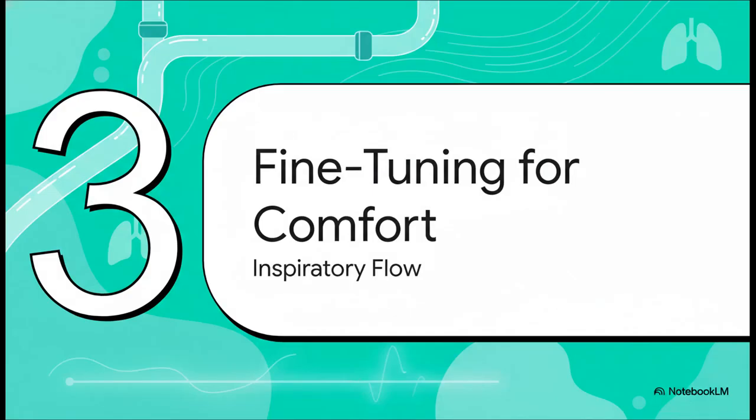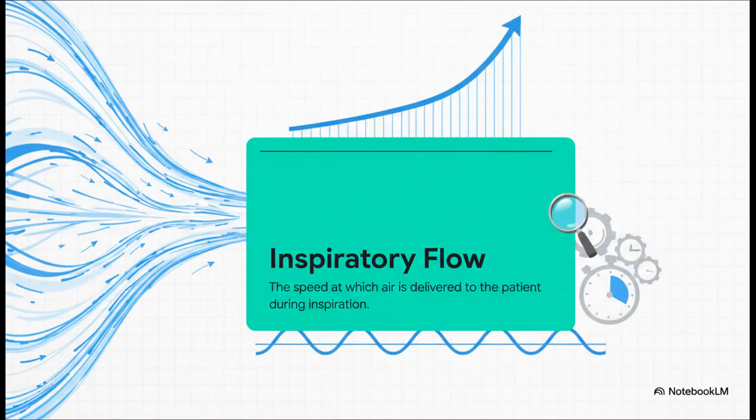All right, we've built the breath, and we've managed oxygenation. Now it is time for the final touch, making sure the breath is actually comfortable for the patient. And that is where our 5th and final parameter, inspiratory flow, comes in. Now, this isn't about how much air we're giving, it's all about how fast we're giving it. It's the speed of the breath going in.